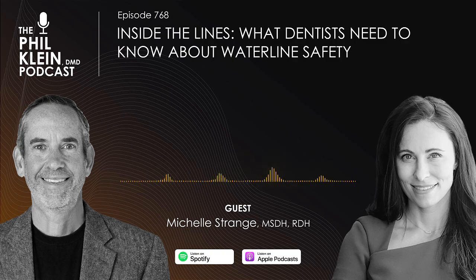And just as a reminder, I say it often on the webinar, it is not your water, it is your water lines. So even if it is coming from city water that is treated, we still have to manage the water line. So having a water bottle is so very important. There is a world where your technicians, whoever works on your units, can come and retrofit that, meaning they pull it off of the city water and put a bottle on that unit.